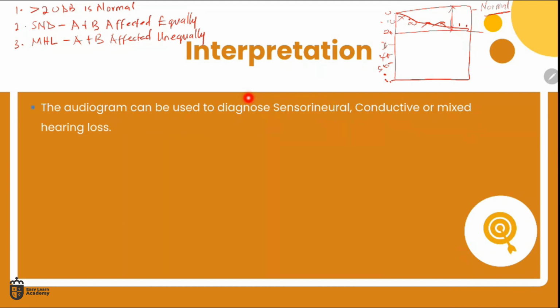Now, the last one is what we call, so this patient first has sensorineural, second has mixed, the third will have a conductive hearing loss. And so for the conductive hearing loss, I'll put it as conductive hearing loss, CHL. And in conductive hearing loss, what happens is that only air is affected.